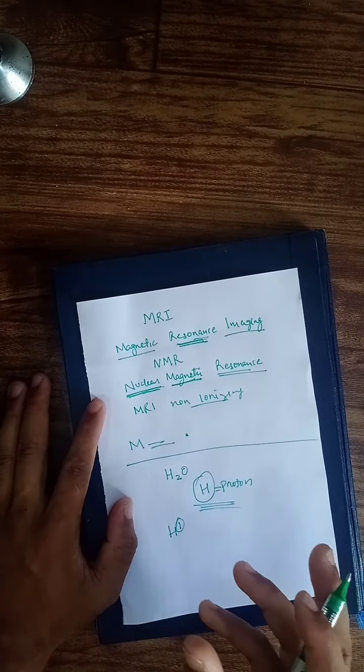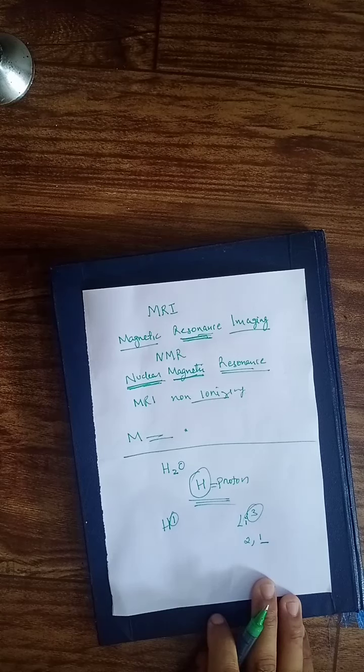By now you might be a bit confused, so let me clarify your doubt about why we are highlighting all these elements. MRI is a machine used for imaging. The proton is present inside your body, because you need to take images of your body structure, especially the internal structure which you can't visualize from the outer surface.